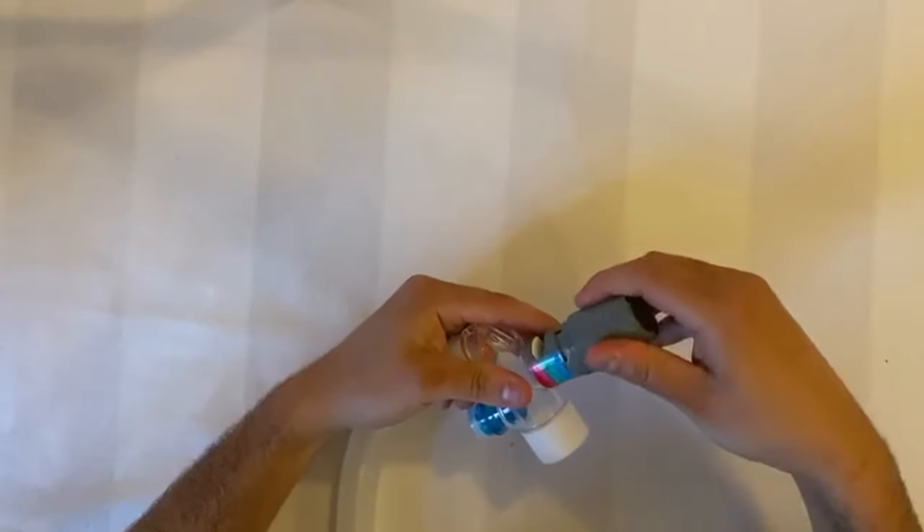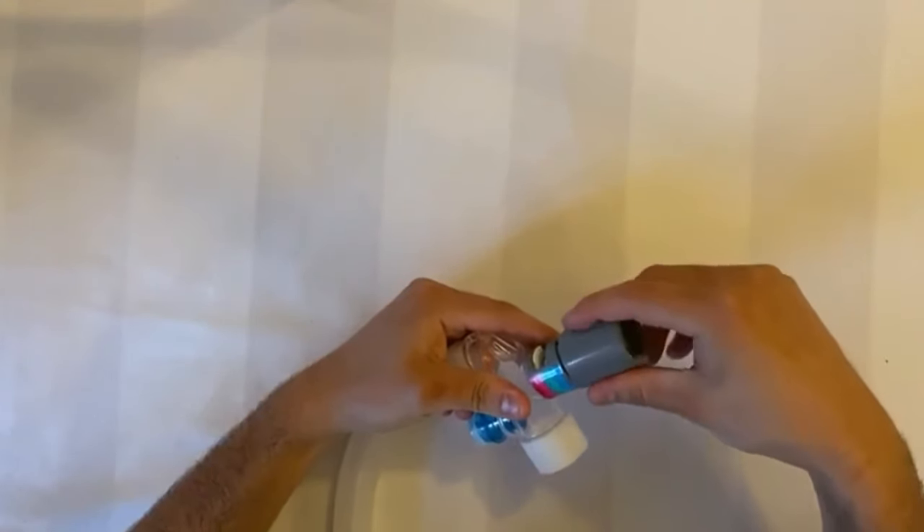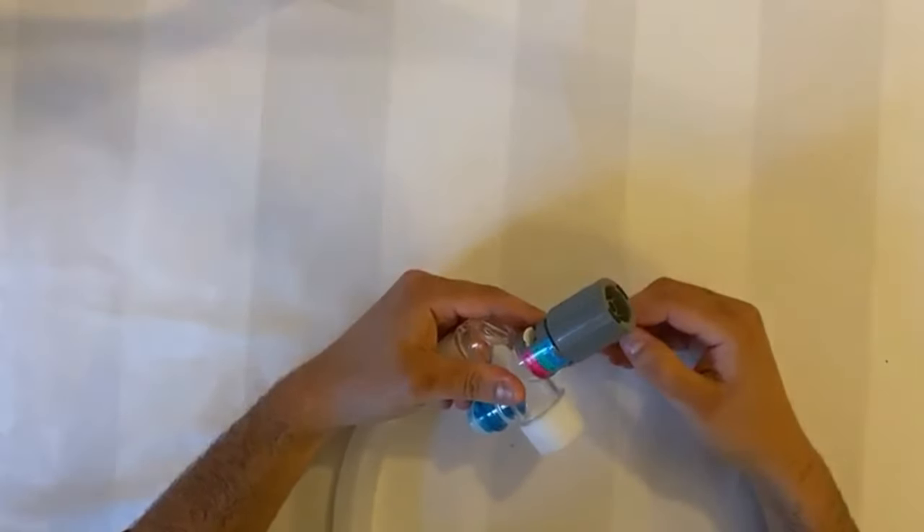Simply turn the PEEP dial to 5, 7.5, 10, 12.5, or 15 centimetres of water to set your desired PEEP and leave.